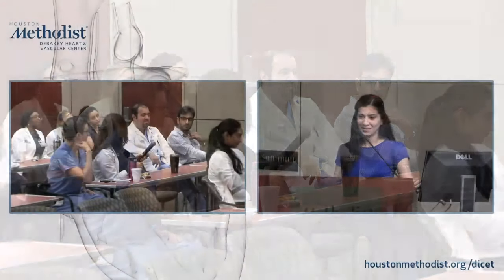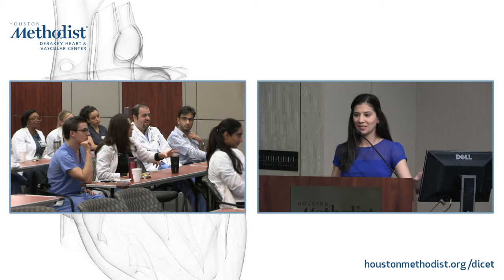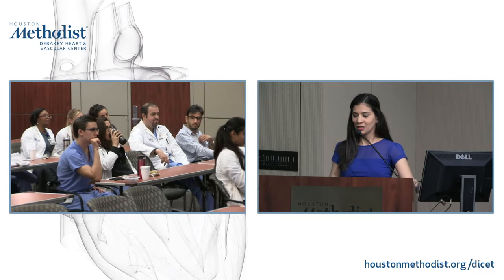That's a great question. Thank you, Shadon. And this is addressed in some of the publications that I mentioned previously about the role of interventional imaging. So again, the most important thing is distance. So where you're not actively acquiring pictures, it's always important to kind of step back. We have radiation pads that go on top of the patients and reduce the amount of radiation that's getting to the imagers. We have radiation skirts. Dr. Little has an extra safety layer. I try to protect him as much as I can so I can learn the best. But it is an issue and it needs to be addressed. And a recent study showed that the imagers are actually getting more radiation than the primary operators. So that's an area where we need further work and advocacy.